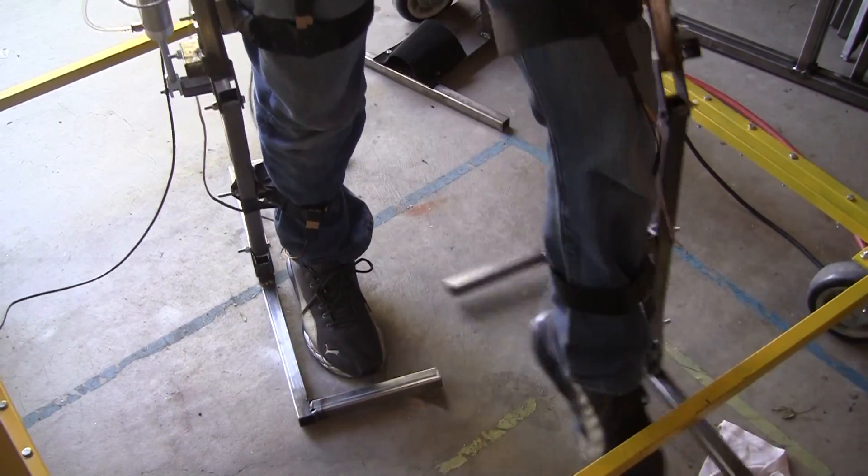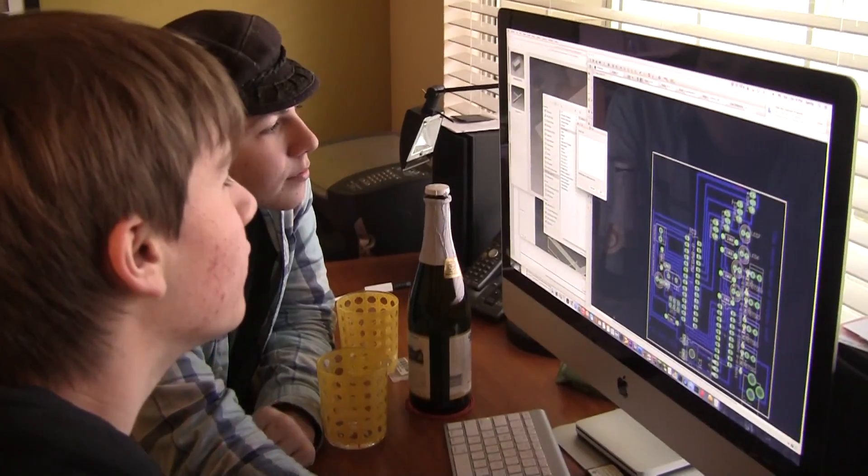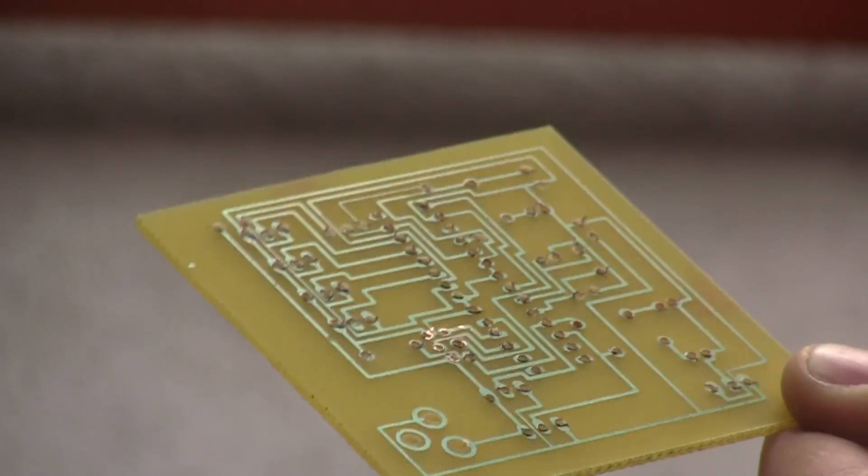We now use force sensors for detecting user movement, and we have a new board layout that reflects this change. It can communicate to a master control Arduino that will send diagnostic information to the laptop.